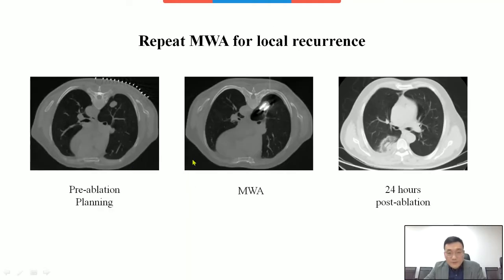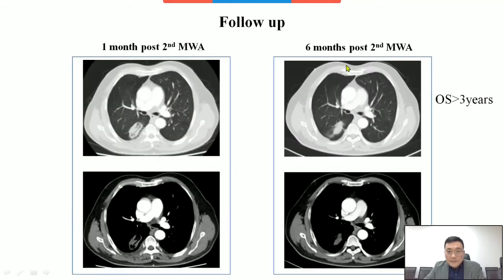So we performed repeat microwave ablation for the recurrent cancer. After 6 months of follow-up, the local efficacy was satisfactory, and the OS for this patient is over 3 years.